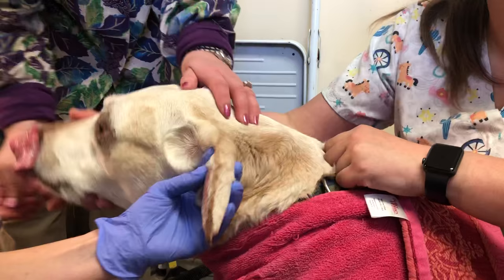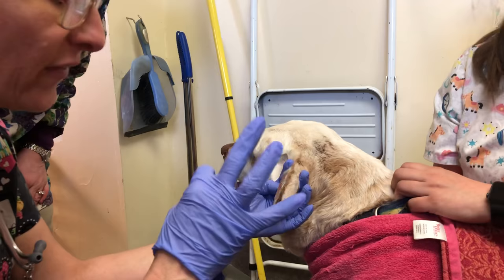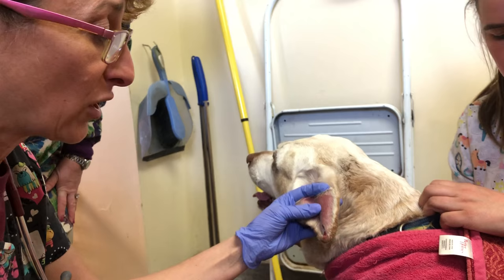I'm going to take an 11 blade — a really sharp blade. We're going to get ready for a little bit of bleeding, and then I'm going to open this up and drain the blood. The problem is if you don't drain the blood, it will coagulate inside the ear and then get a really crinkled appearance. If you see dogs with crinkly ears, it means they've had recurrent ear hematomas.